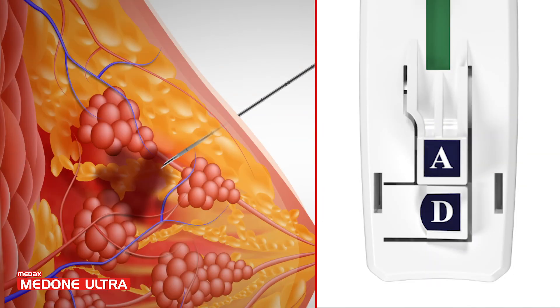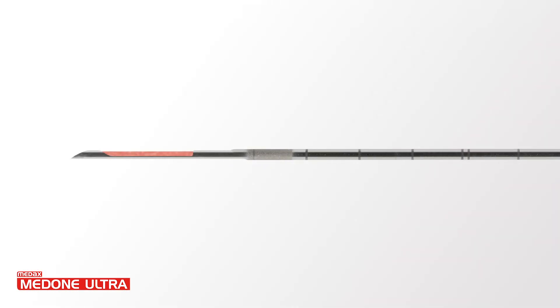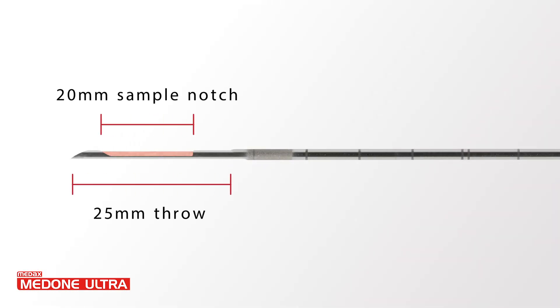The automatic firing mode may be chosen for a quick sequence of stylet and cannula to collect samples by pressing the A button. Pull back and release the loading levers once to retrieve the tissue sample.